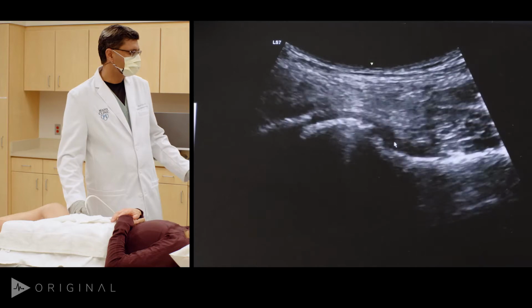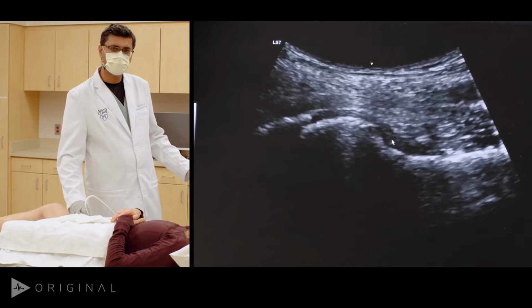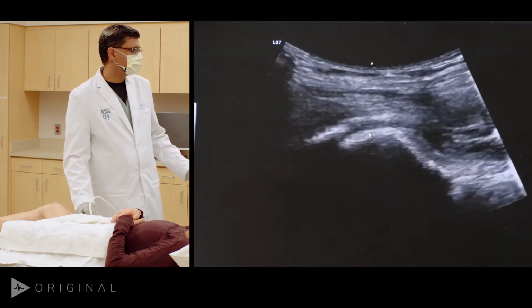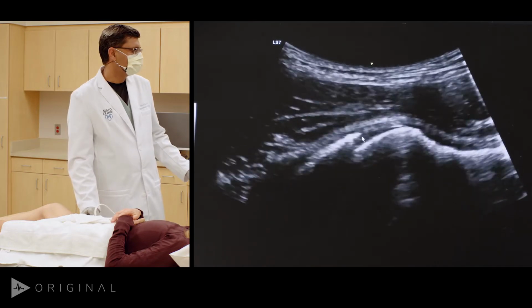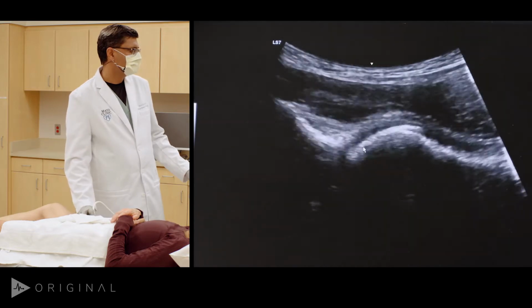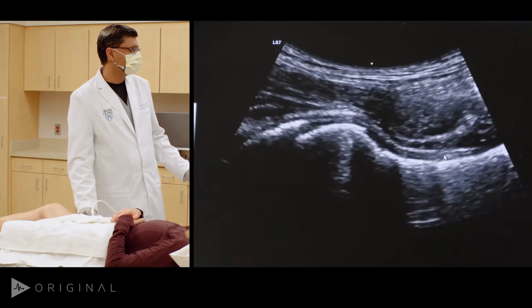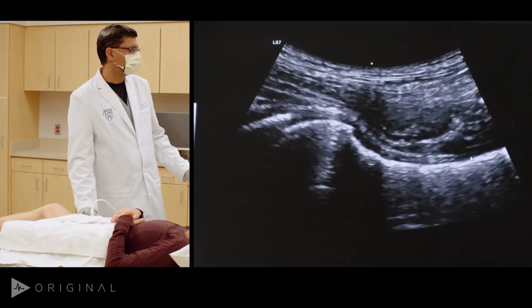If you can get the injection in this spot, you pretty much have got the injection in the area of the hip joint. Now, sometimes if you are able to get a good angulation, you might be able to see the labrum anteriorly. In this instance, it's just a little bit more difficult to find that hyperechoic wedge of the labrum. Now, the capsule is really well seen, and you can see I'm pressing hard here to show a very nice uniform capsule as it comes down to the neck and then makes a reflection.